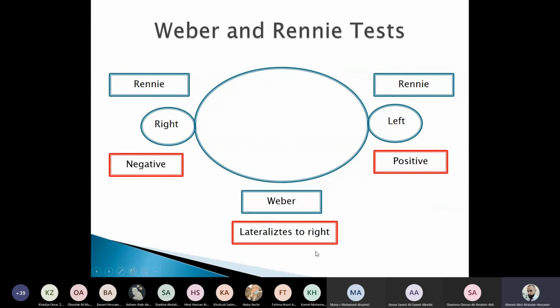It's by doing the Rinne test. So Rinne test on the left side was positive, meaning that the left side is normal. So the Rinne test will tell us either this patient has conductive hearing loss or doesn't have conductive hearing loss. Now, how about the right side? What could Rinne tell us? Now, Rinne is negative, meaning that here bone conduction is better than air conduction on the right side. So how can we interpret this? So from Rinne itself, what do we have on the right side?